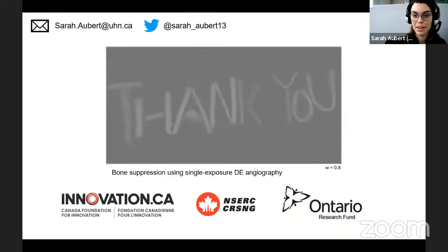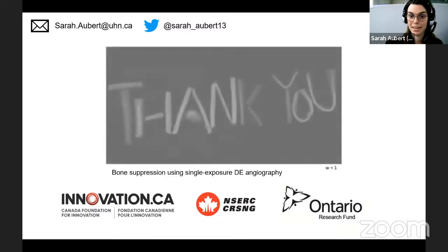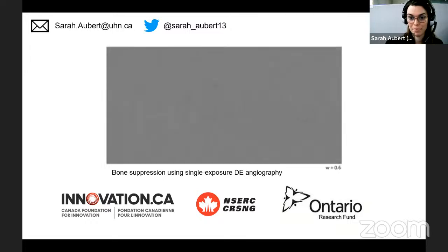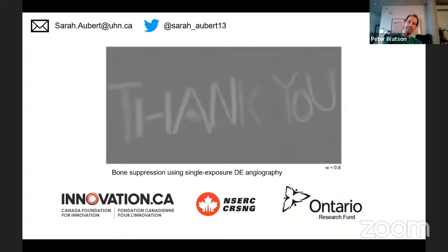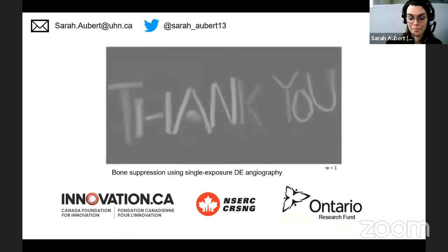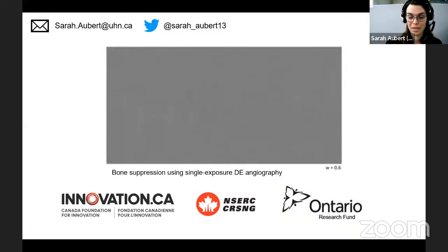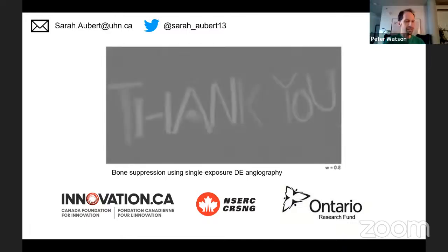Yeah, it magnifies in the image, so the field of view was fixed at the SSD. So it was a fixed 12 by 12 hitting the surface of the detector. On the detector, okay. But in our larger air gap images, we actually only have one vessel because of the magnification; you're not able to see all three. Okay, that makes more sense.